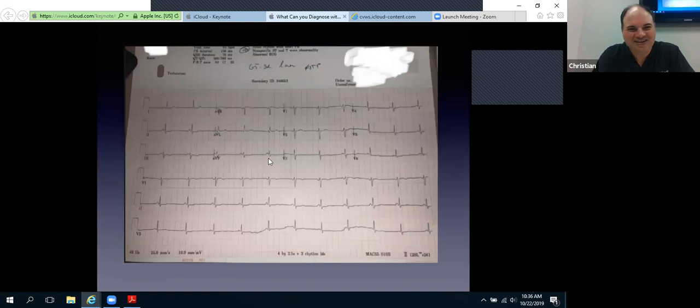No, yeah, right. So what was interesting about this patient was that you see how the P wave is so close to the R wave? Like the PR interval is extremely short there. And so I saw the EKG and I'm like, oh, I'm going to grab this one right now. The rate's 65, sinus, normal axis, there's no ST elevations. There's nothing that when you look at that, you go like, oh, this is something I need to see right away. But that short PR interval is a sign of what's called a pre-excitation syndrome.